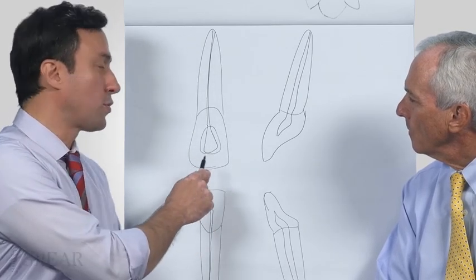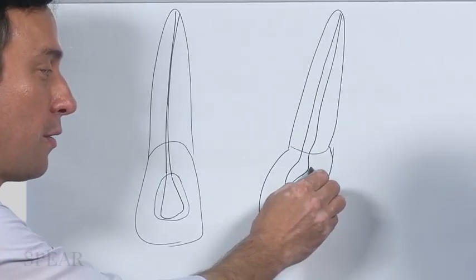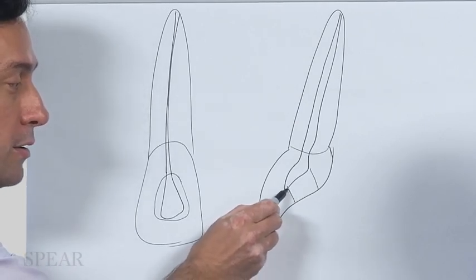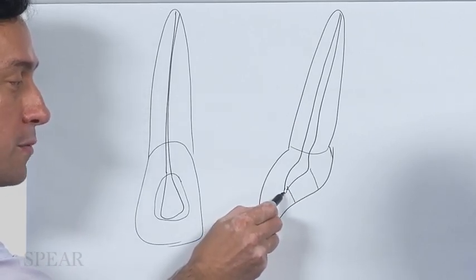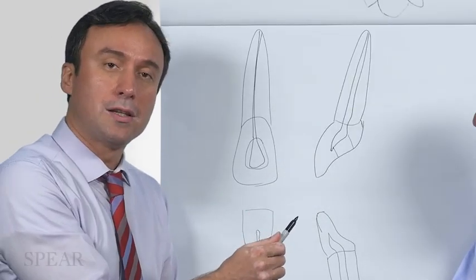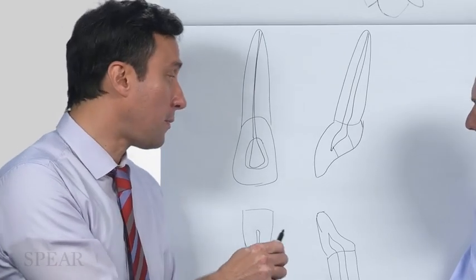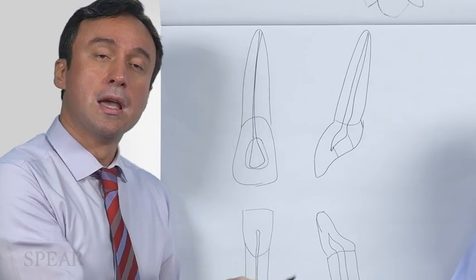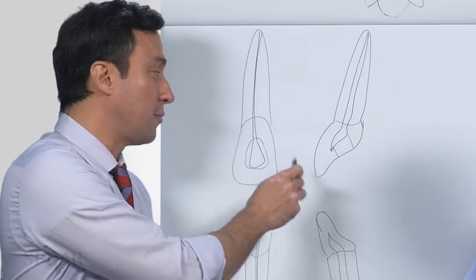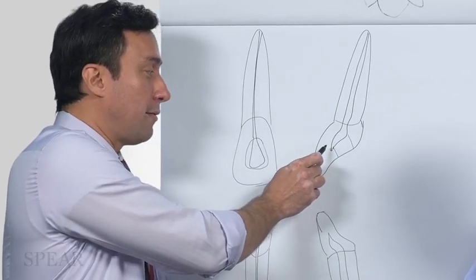That is the way to preserve the most tooth structure. So you are coming in from the side, and this would be your access preparation as you try to get in. You have to be careful not to leave part of the pulp horn behind, because this pulp horn, especially in a necrotic tooth, will contain bacteria as well as maybe some dead erythrocytes, which will create staining in the tooth following the treatment and require bleaching as a result. So that's the main thing to remember there.